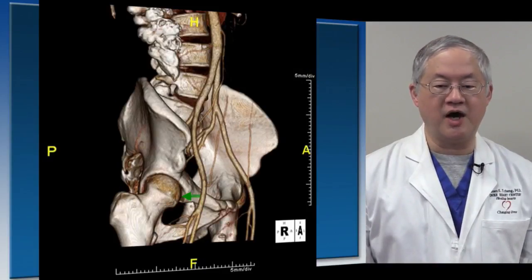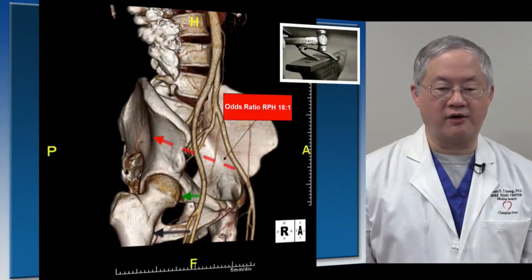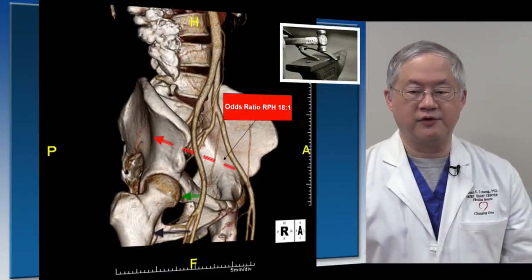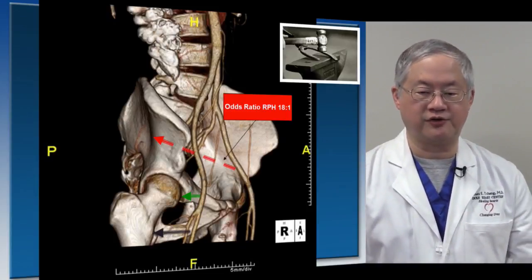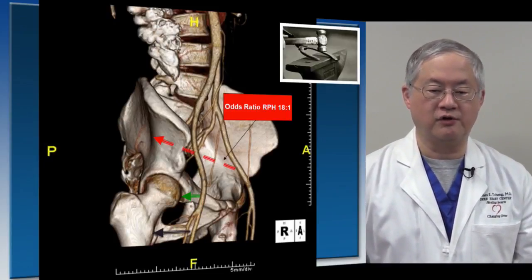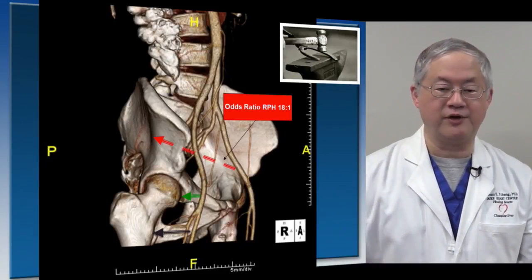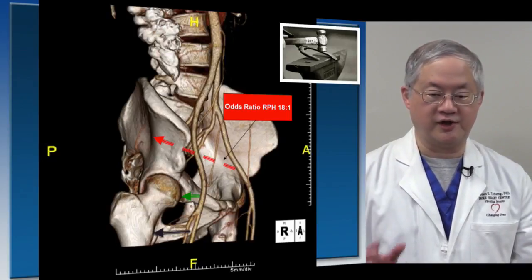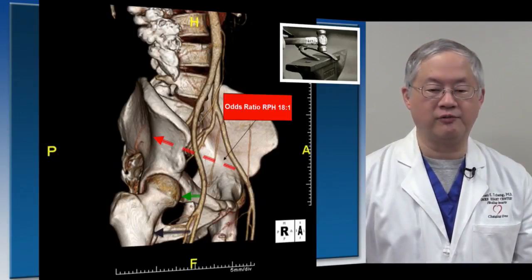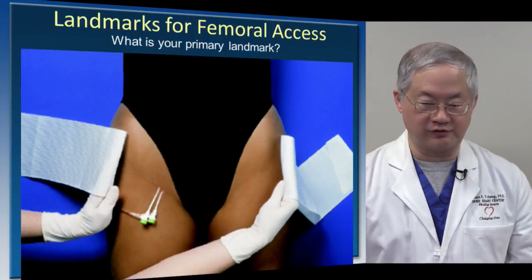And when you're sticking high, up in this red area, the odds of retroperitoneal hemorrhage and hematoma actually increase upwards of 18 to 1 over other locations. As you can see up in the abdominal cavity, you're really not pushing against anything. And so I think it goes without saying why this, at least for the first point, would be a great place to establish femoral vascular access.